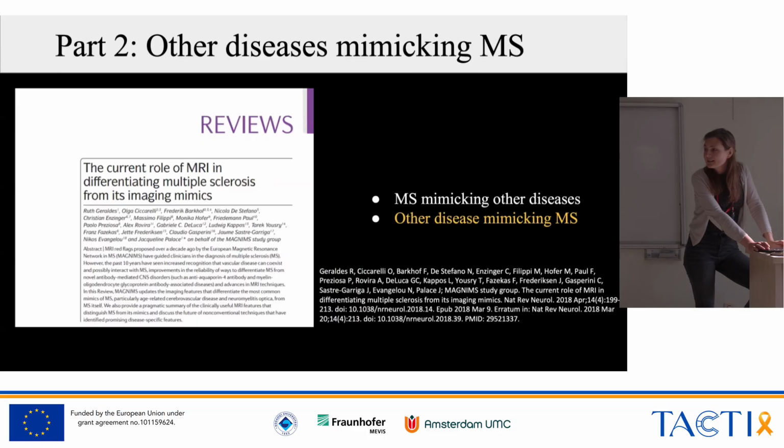If you do a repeat scan and see exactly the same contrast enhancement, that is very abnormal, because MS lesions lose their contrast enhancement after a while. If it persists, it's indicative of something else. Not necessarily cancer, but it could be some other, more persistent inflammation, like sarcoidosis, for example.